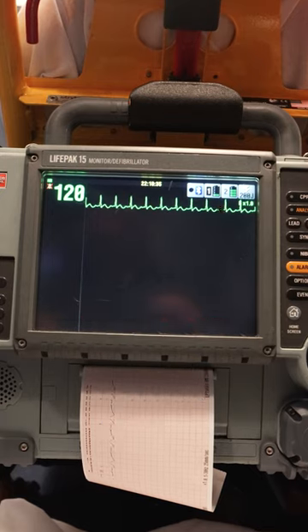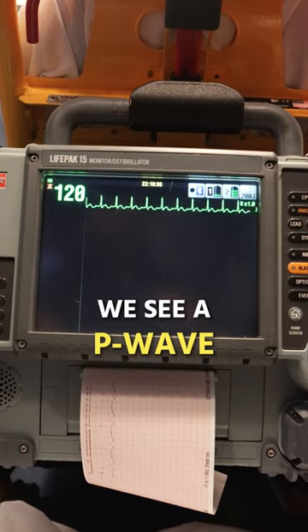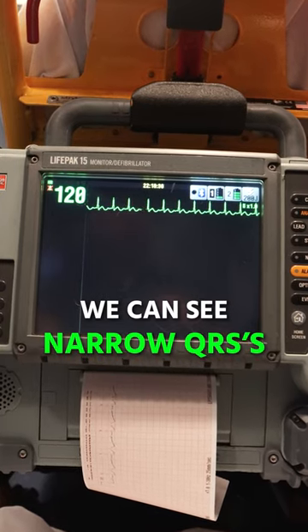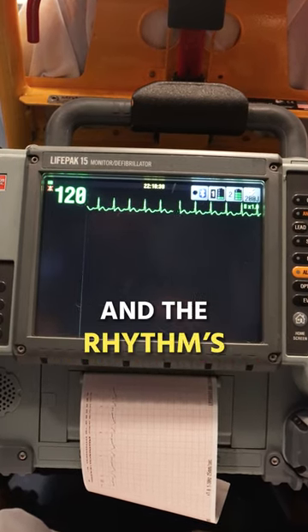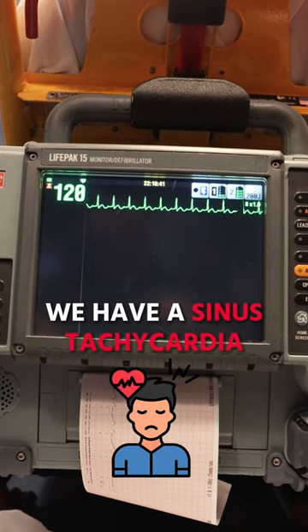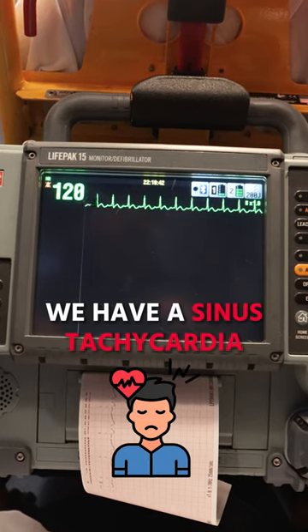We see a P wave, we can see narrow QRSs, and the rhythm is regular. We have a sinus tachycardia.